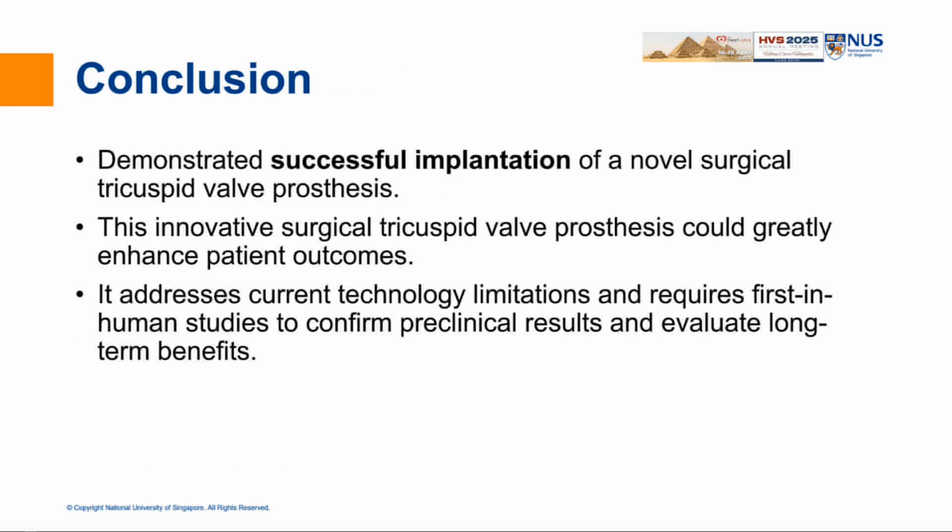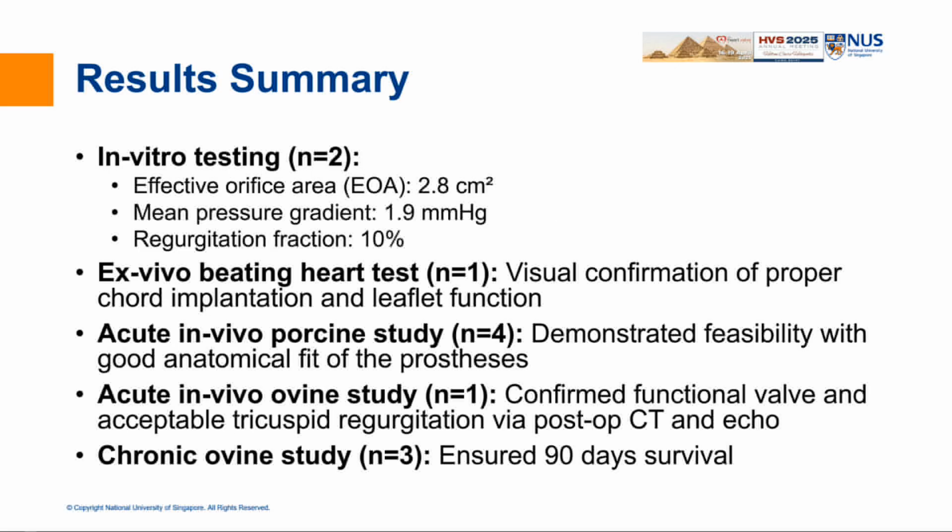As I said, we have done 4 porcine studies, which were acute, that demonstrate the feasibility with good anatomical fit of the prosthesis. And in 1 ovine study, I have just shown you the fluoroscopy. Lastly, the chronic animal study literally finished yesterday and showed 90-day survival of all 3 recipients.